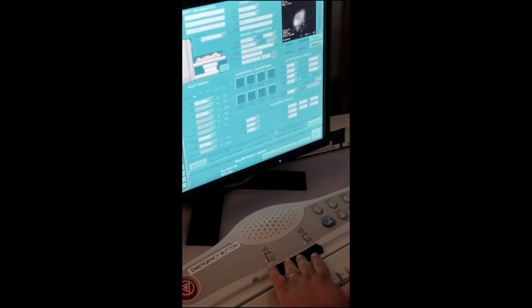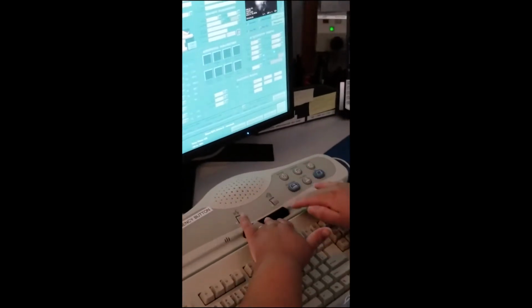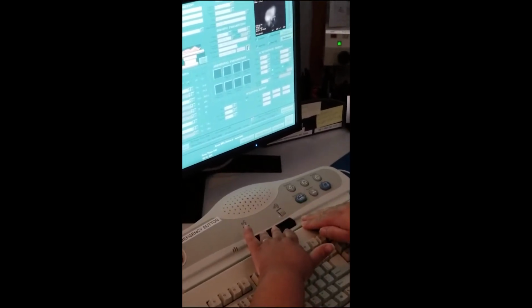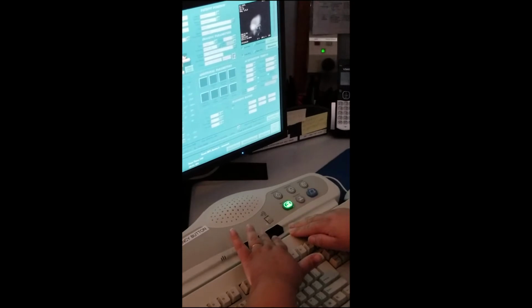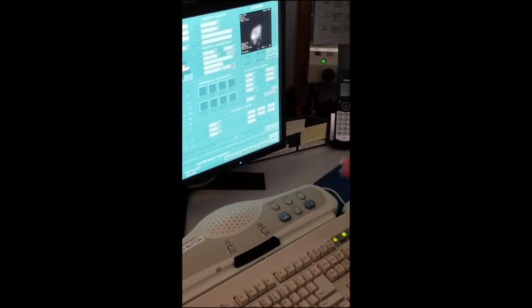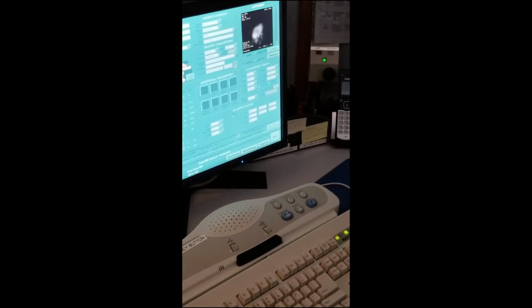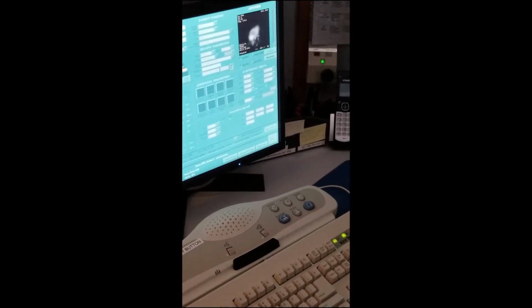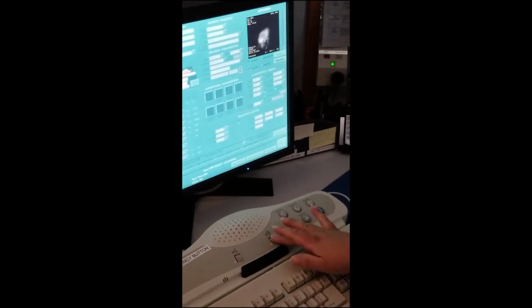Hi, Eric. How are you doing? All right. The next scan is going to be about a minute. Here comes the noise. And the table's going to move. Okay. All right, so now the next one.